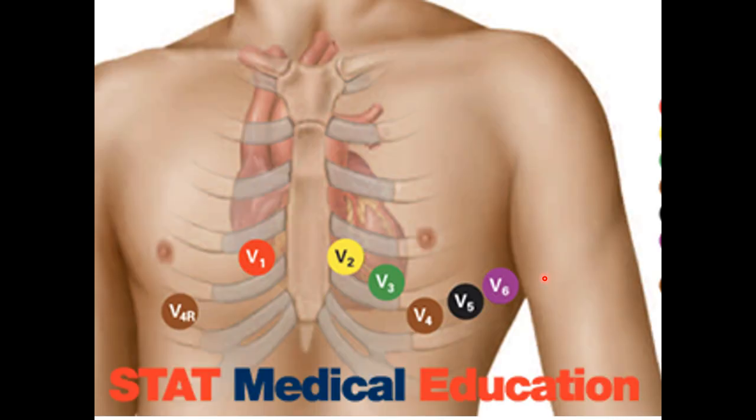This is the color coding of the chest leads. The V1 is red, V2 is yellow, V3 is green, V4 is brown, V5 is black, and V6 is purple. So this is how you will identify these leads on an actual machine.